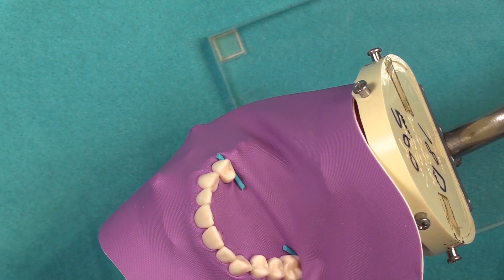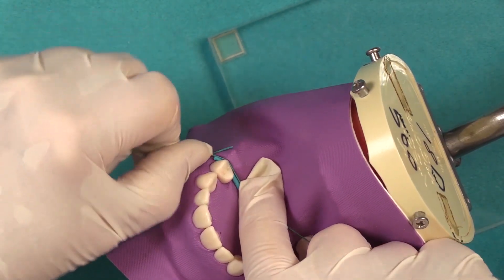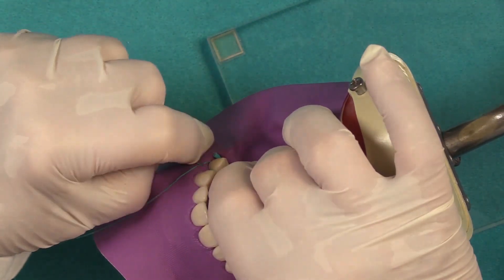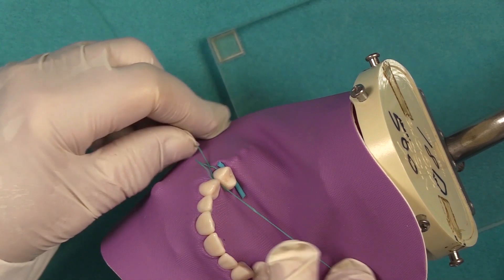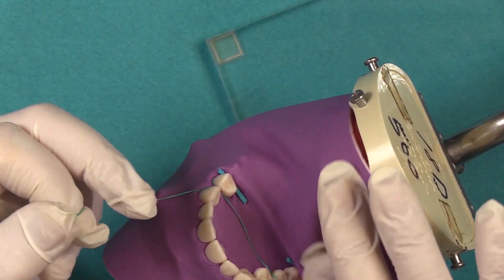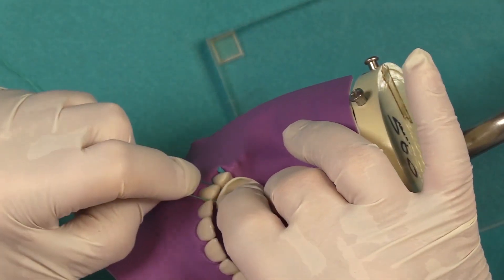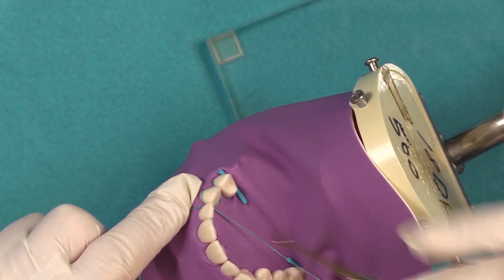The shoelace ligation works by taking equal lengths of your floss on both sides — just like a shoelace. You come in here and run your floss that way, then the facial goes to the lingual, and you tuck it as you're working with this, keeping a little tension. Then my lingual goes to the facial and my facial floss goes to the lingual, just like a shoelace when you're doing your shoelaces.